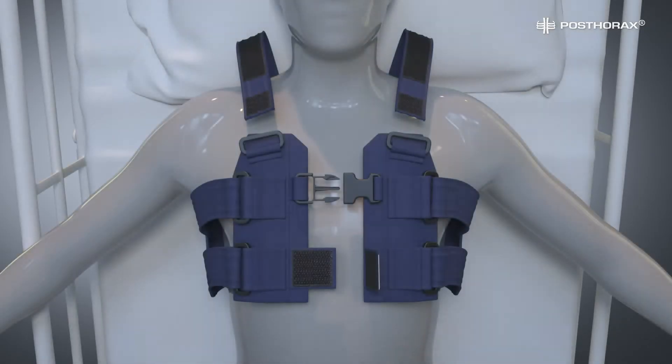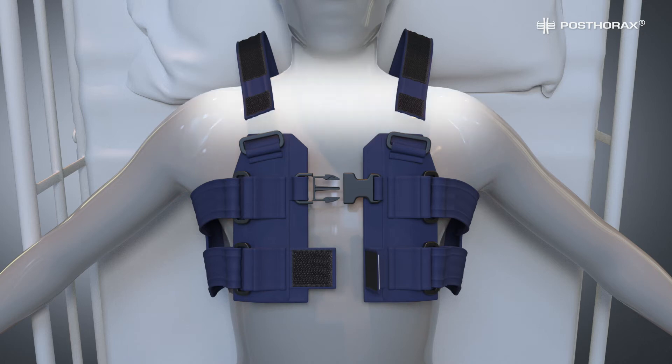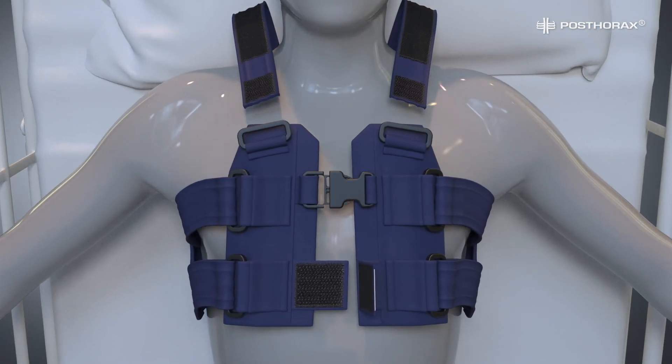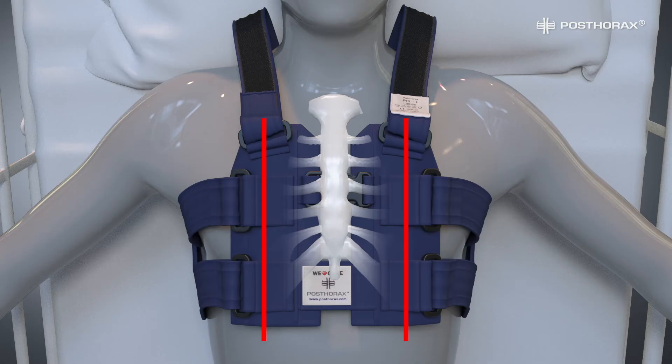Before closing the front buckle and Velcro closure, be sure to reroute any electrodes from the chest and neck area. They can be placed in the collarbone area or below the vest to create a clear space for support cushions and shoulder straps. Reattach the shoulder straps in a loose position with the support cushions running parallel to the left and right of the sternum, with their top sitting directly below the collarbone.